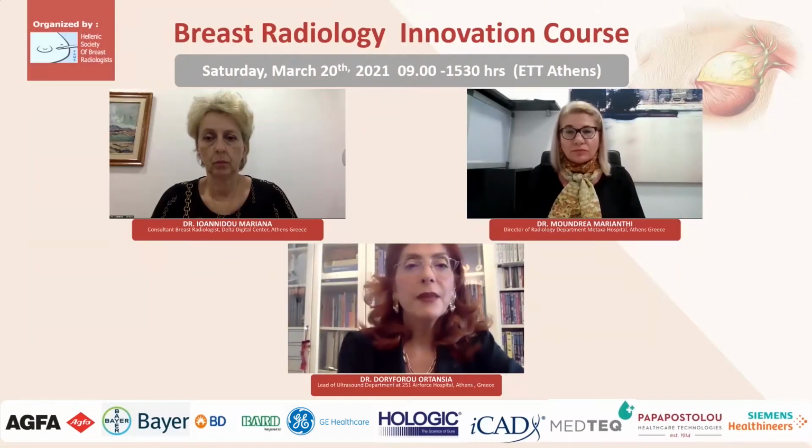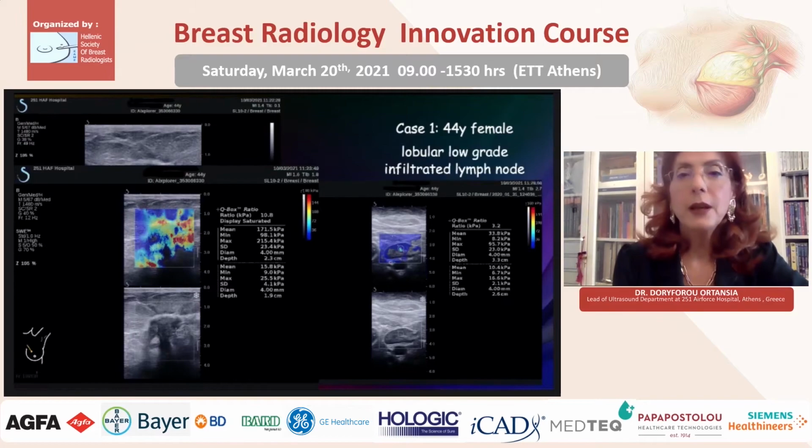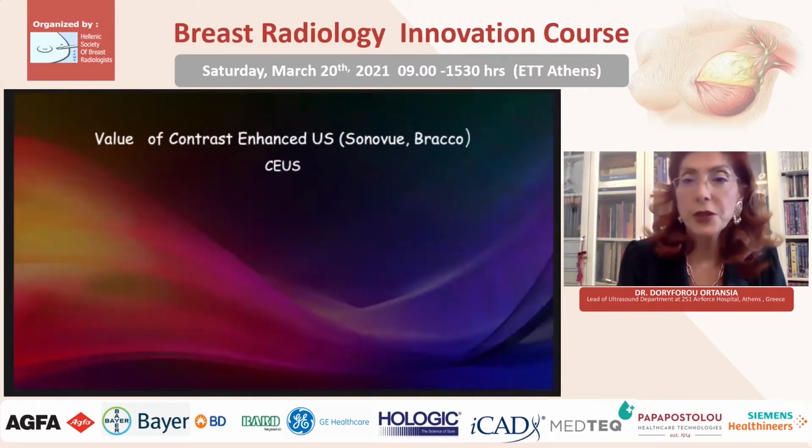Okay, so the tip of this slide is that I did elastography on the lymph node, and there was a stiff value, and it was an infiltrated lymph node. Let's move now to the next part of my talk, which is the value of contrast-enhanced ultrasound.